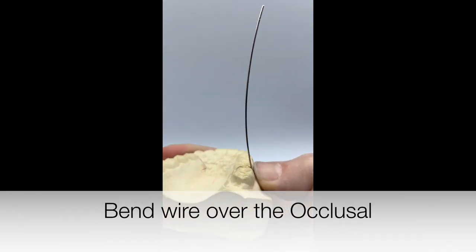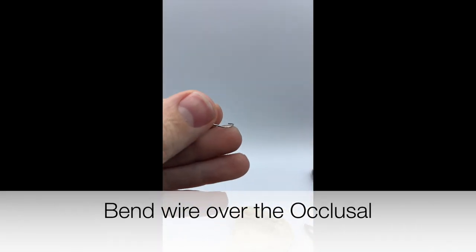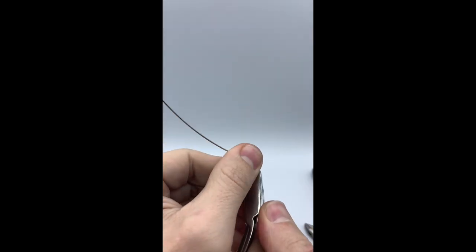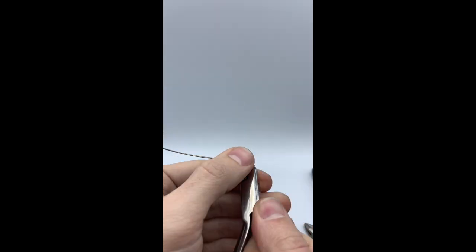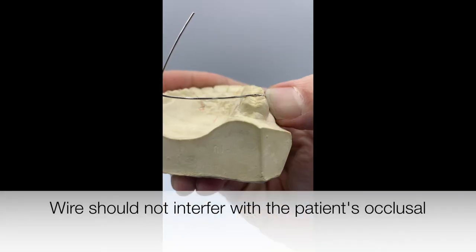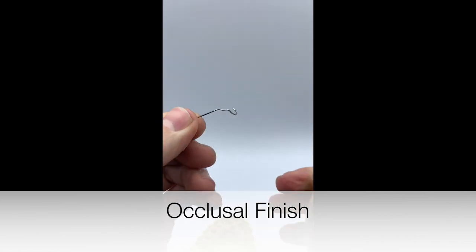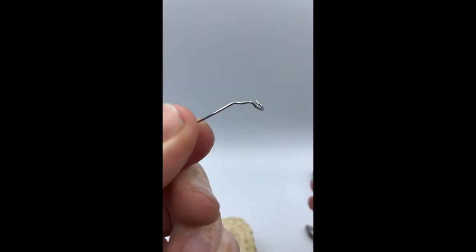Our next step will be to bend over the occlusal surface. We want to make sure to mark the area that we need to bend without interfering with the patient's occlusion. Now you could finish your occlusal in two ways: straight across or you can make an up and down bend to give it the contour of the cusp.